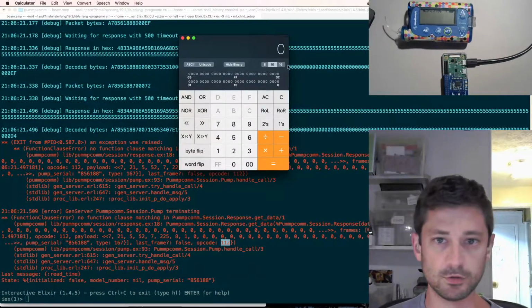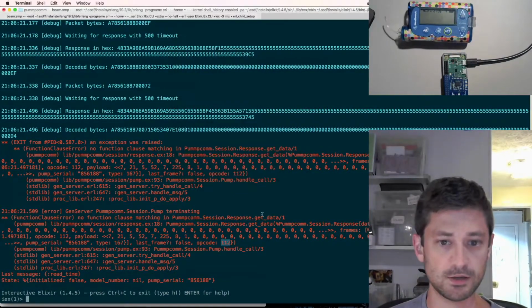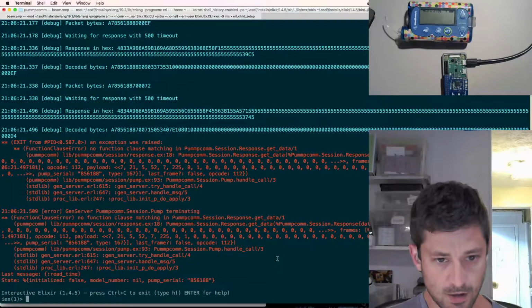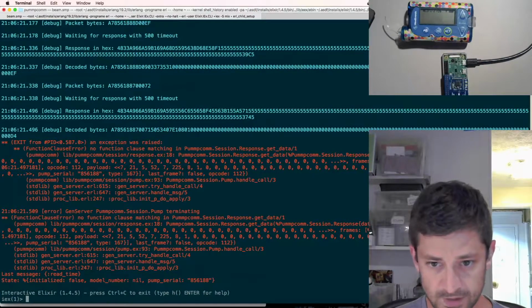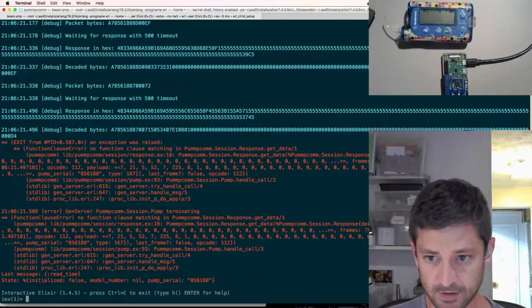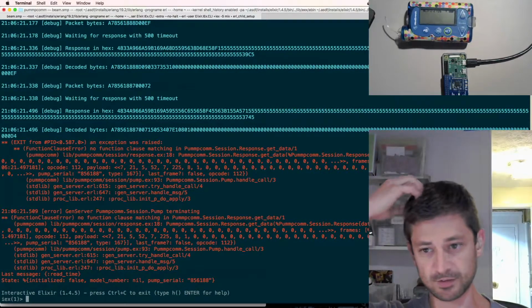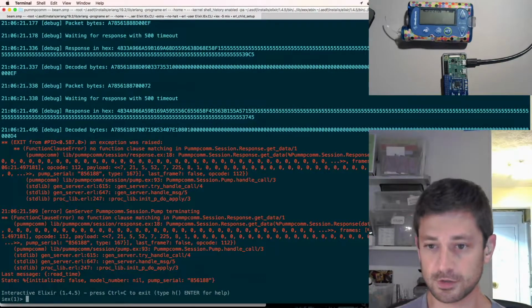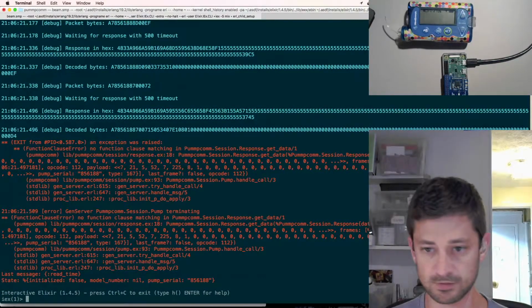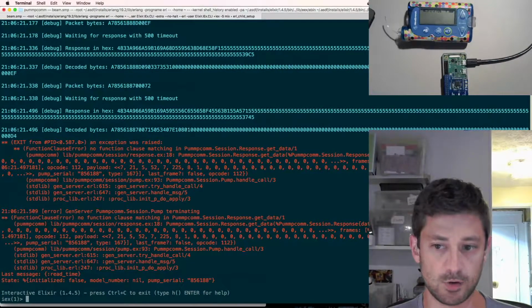Opcode 112. Okay, that's my get time command. So here's my data, and it's basically saying, yeah, you get all the bytes back. For most responses, there's 64 bytes of data, regardless of whether or not it actually uses those, just to keep the packets similar, I guess, or something like that. So what I'm seeing here is 1, 2, 3, 4, 5, 6, 7, and then a whole bunch of nothing.